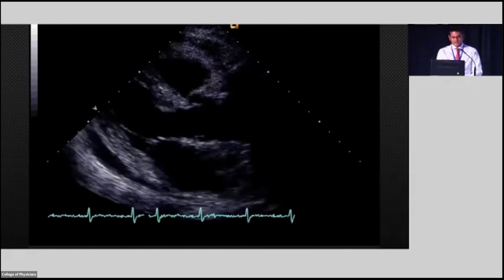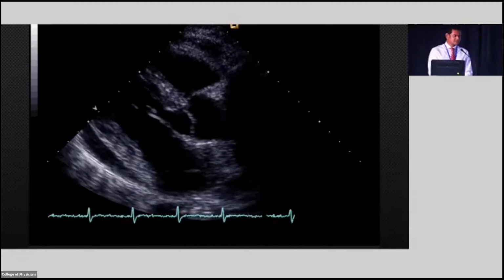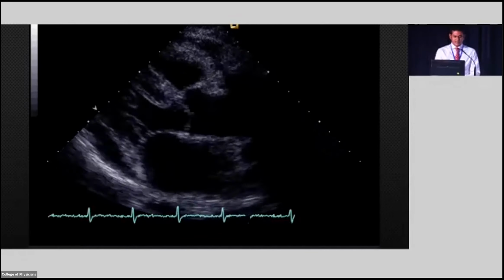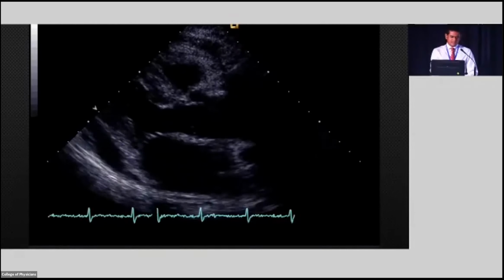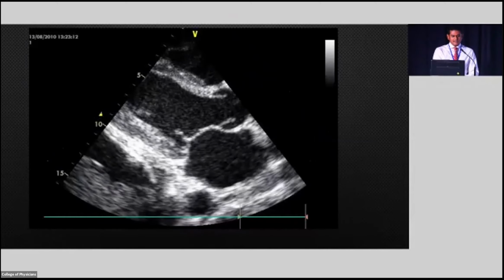So now we have a question. This patient who had a dissection, now he's dropping his blood pressure with inferior ST elevations with a fluid, the pericardial fluid. So this is basically a case of a tamponade. So identifying a tamponade or a pericardial effusion, this is a good landmark.